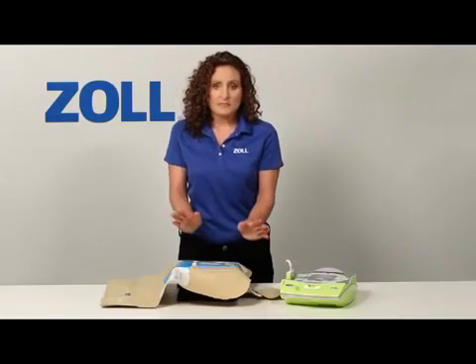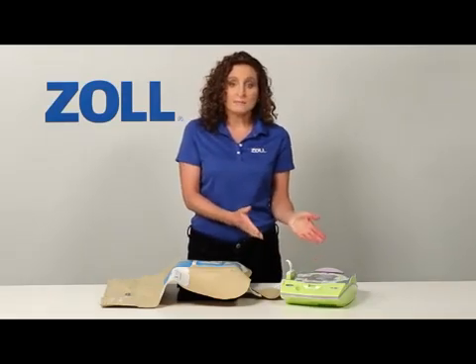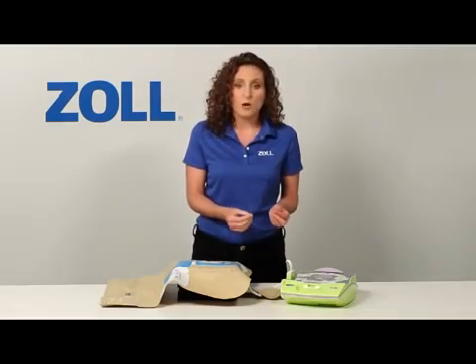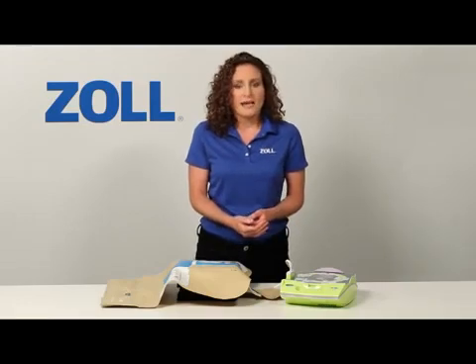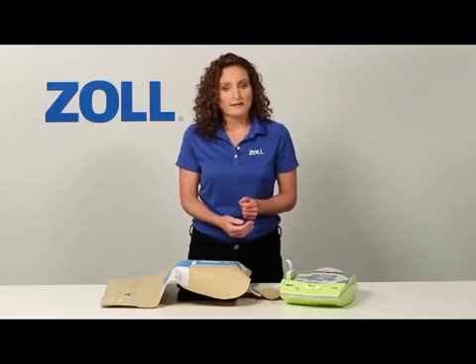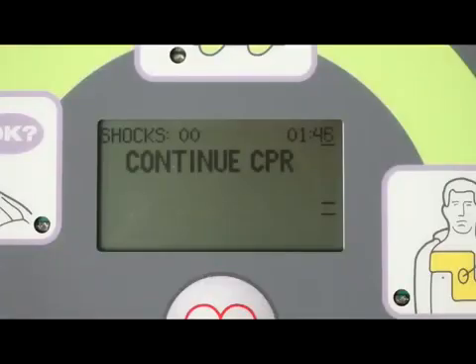Now, if I stop CPR before the AED Plus tells me to, Real CPR Help continues watching for my compressions, and after 10 seconds with no compressions, it will prompt me again. Continue CPR.